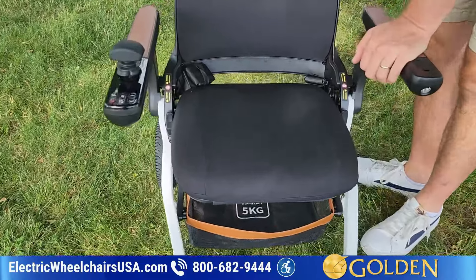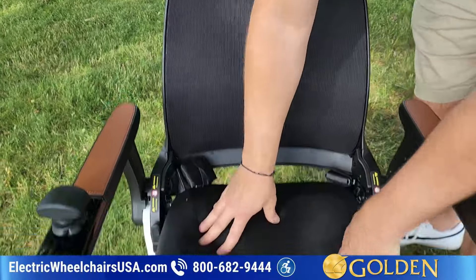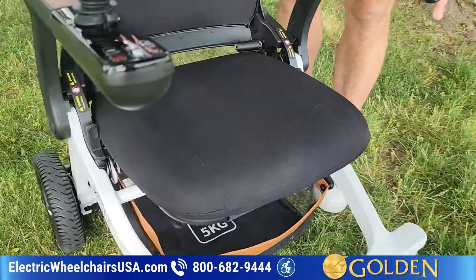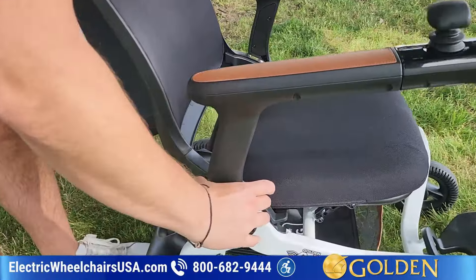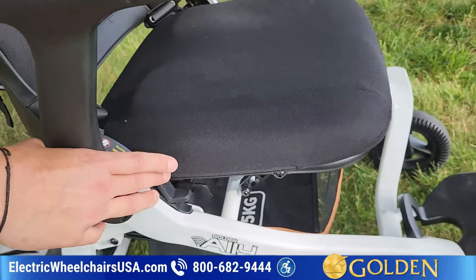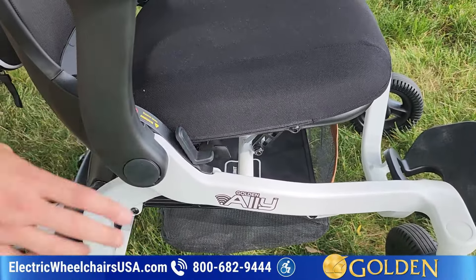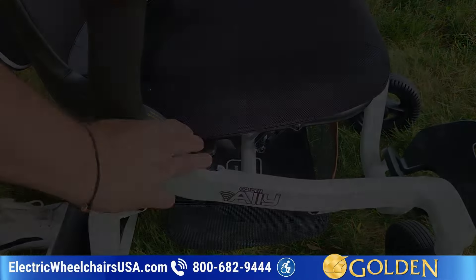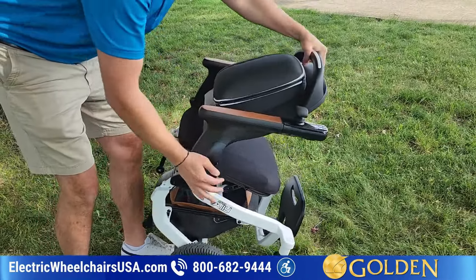The seat is also very comfortable. It has this breathable material on the back and a nice cushioning. To fold it — it's really simple. You press this lever right here, and there's one on each side, so whether you push on this side or the other, it's going to move both of these. When you fold it, you can fold it like that.